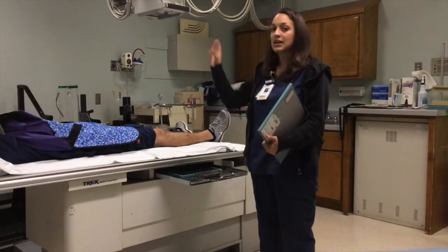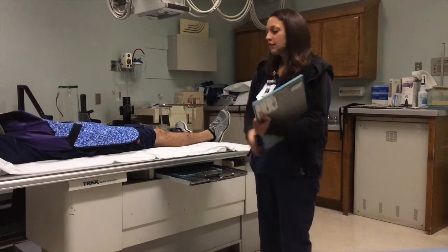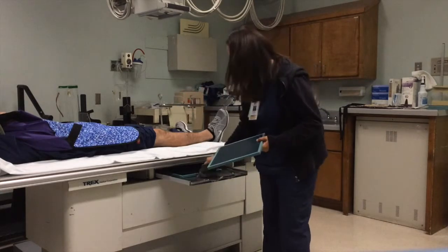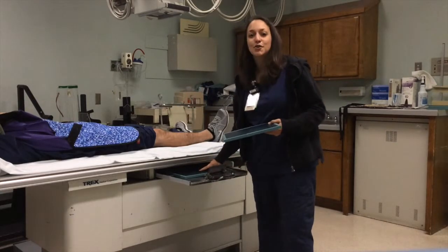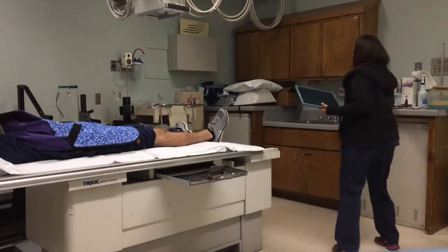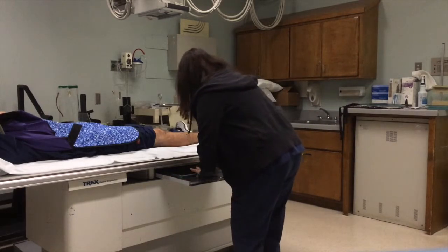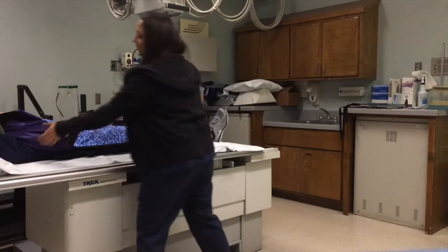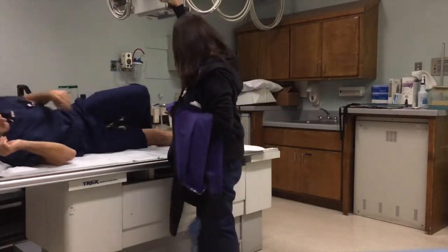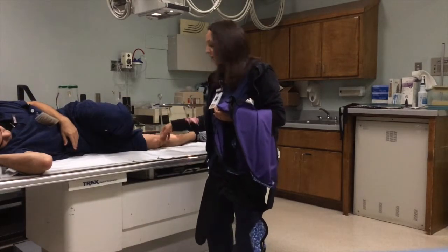Now for my last view, there is no ASIS measurement that would be involved with this, but I will go ahead and angle my beam 5 to 7 cephalad so I can get into the joint space, and I'll show you. Rotate to your right side on your right hip. We're going to bring that knee down on the table, and the patella is perpendicular with the board.